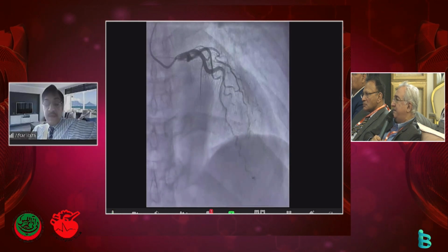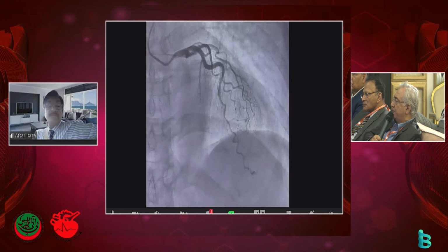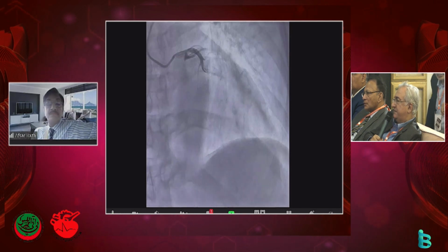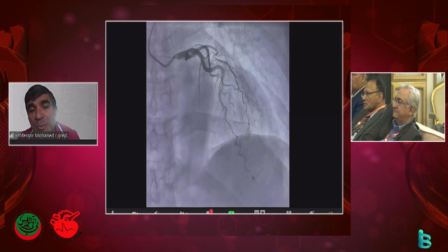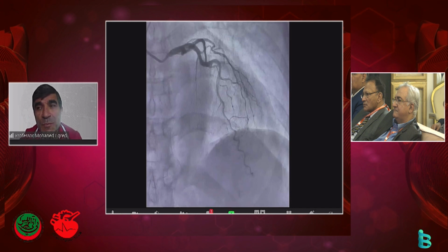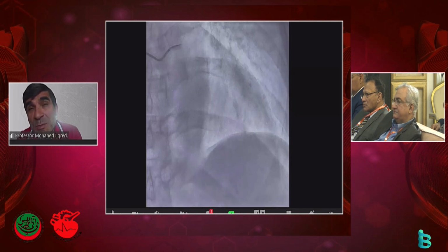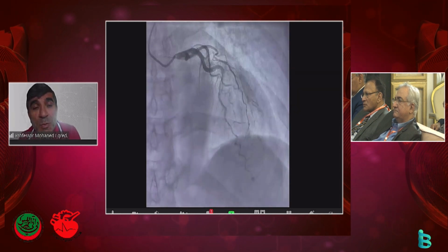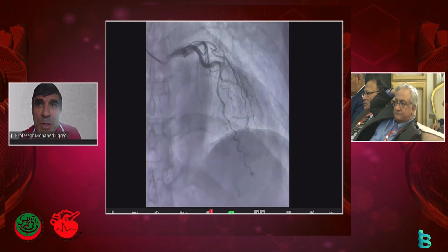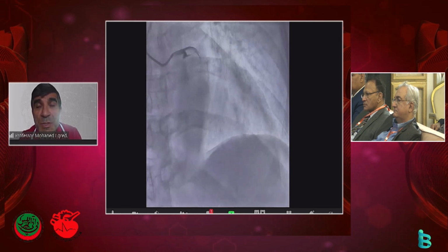The way it happened, people don't realize we don't fluoro everything, but air is the most likely thing which went down the RCA, the LAD. Yeah, I mean, you might be correct. Often with air, you see almost biphasic flow, jumping slowly. The only reason I'm saying spasm is because I've seen that before. One of my fellows was doing a case and put the diagnostic catheter in. You could see the arteries started at a decent diameter, and all of a sudden everything started to close down.